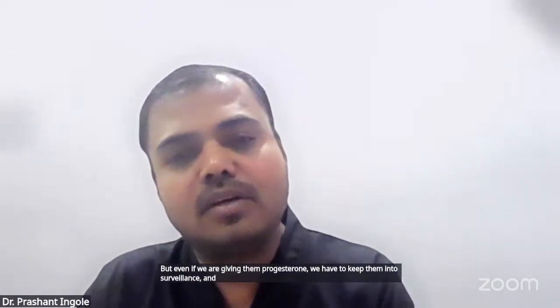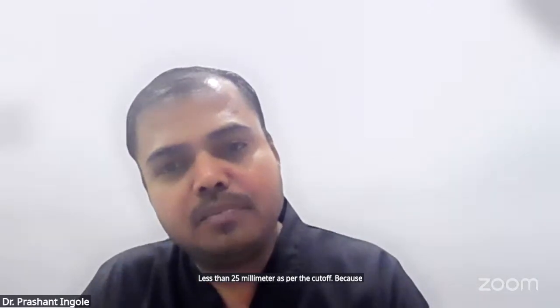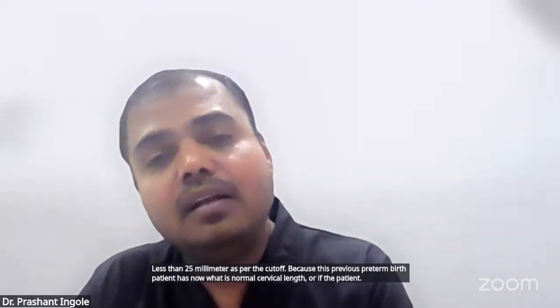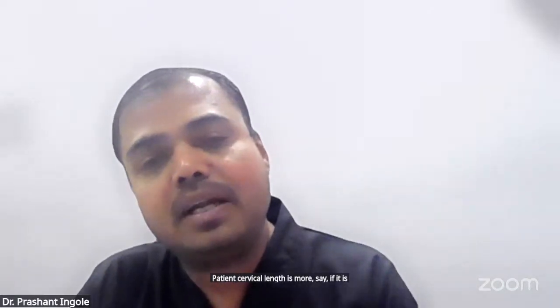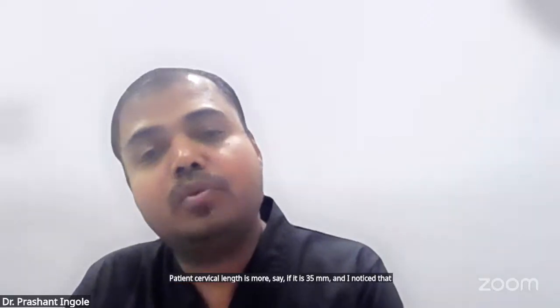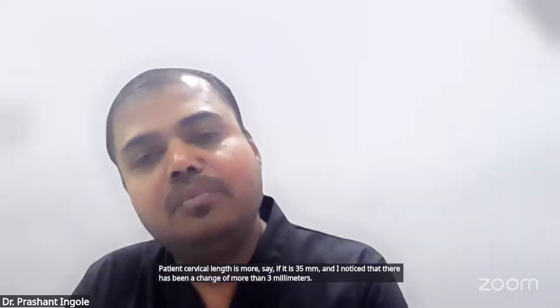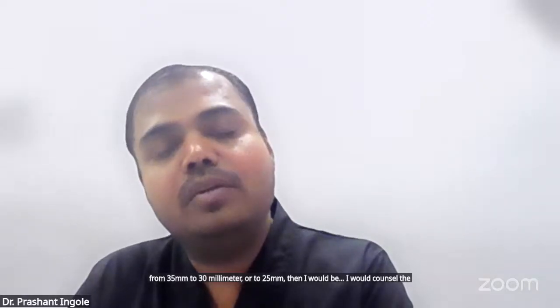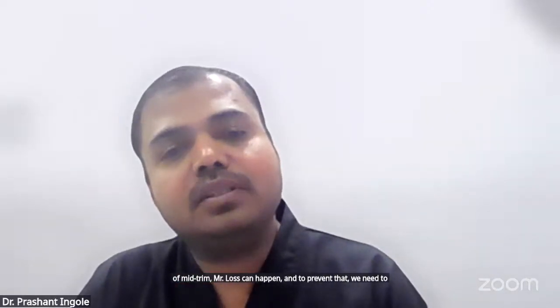And if the length goes down to less than 25 millimeter as per the cutoff, or if the patient's cervical length is more, say 35, and I notice a change of more than 3 millimeters, say now in 2 weeks' time the cervical length has gone down from 35 millimeters to 30 millimeter or to 25 millimeter, then I would counsel the patient to immediately go in for a cervical encirclage, because the process of mid trimester loss can happen, and to prevent that, we need to go ahead with the cervical encirclage.